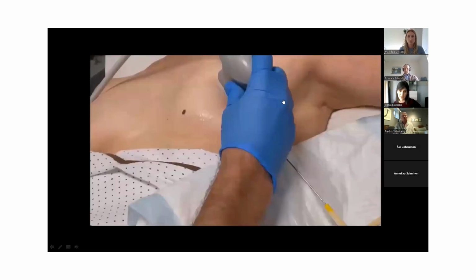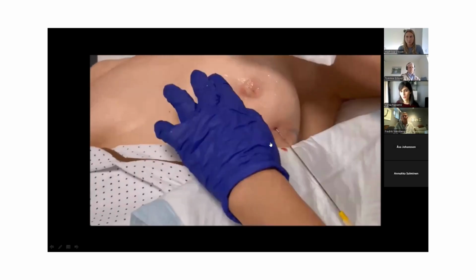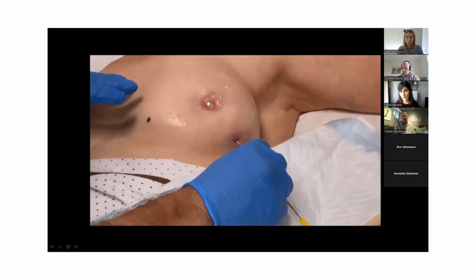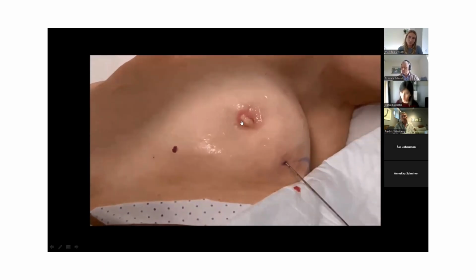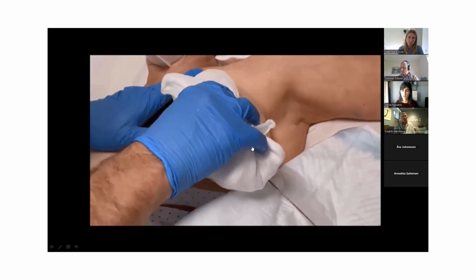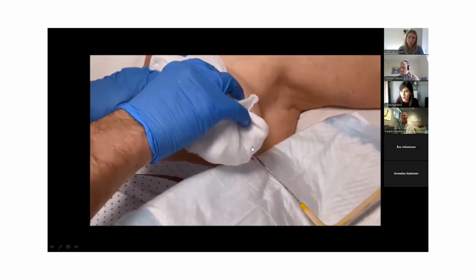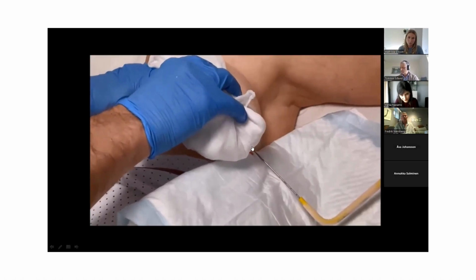This is a different patient, but also with the papilloma located inside the nipple, so you can see better how we do this. The nipple is white, as you can see. We are freezing it. We hold on for a little bit, and then we put the hot saline back. And you're going to see again how easily the nipple recovers its normal color.